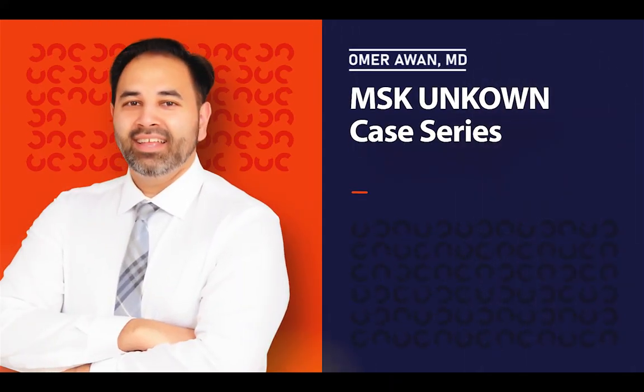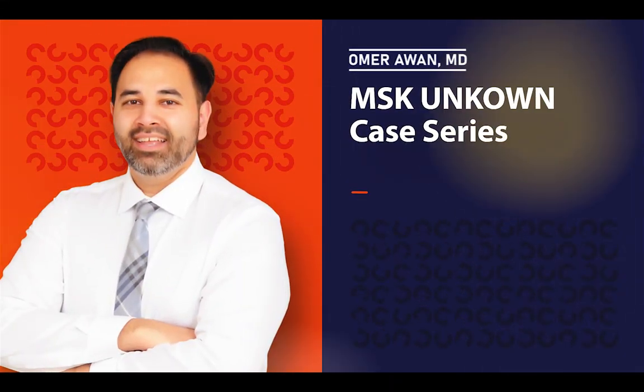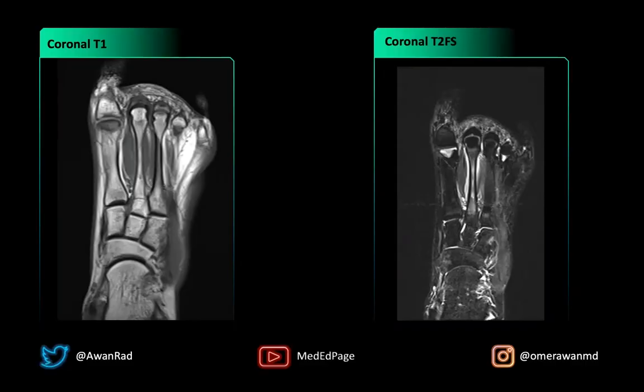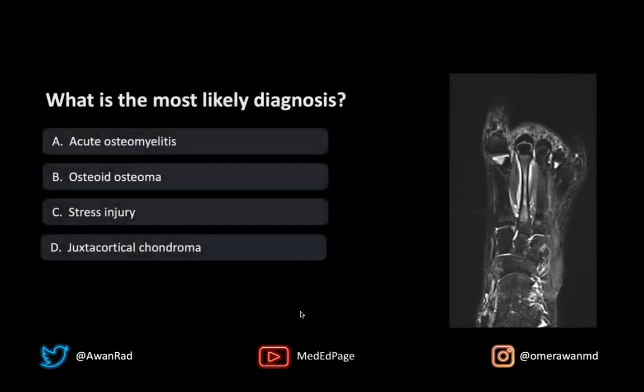Hello, and welcome to MSK Unknown Case 82. Here we have a fantastic case. We have a coronal T1-weighted image through the foot and a corresponding coronal T2 fat-sat image through the foot. The high-yield question here is: what is the most likely diagnosis?